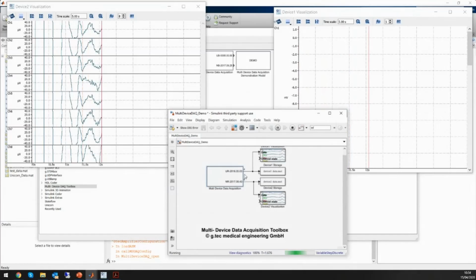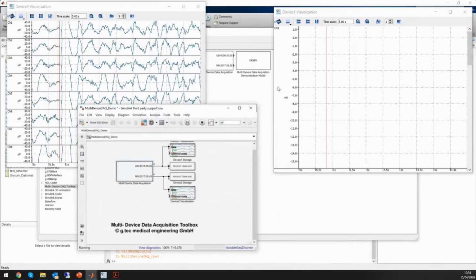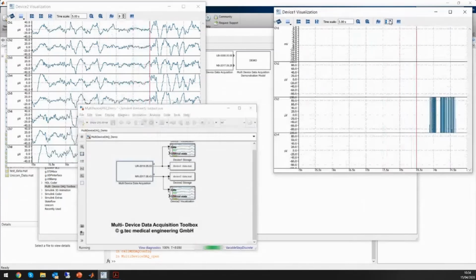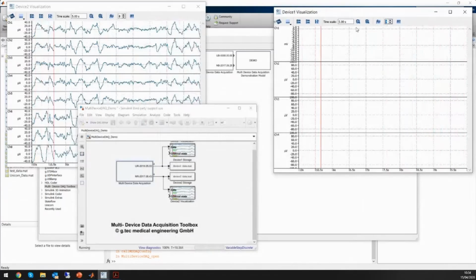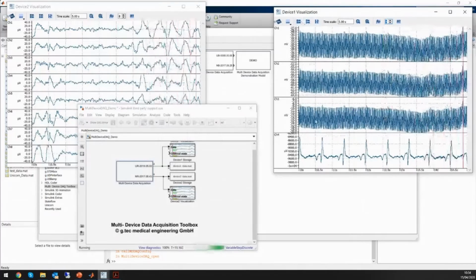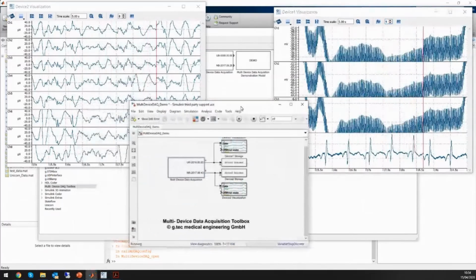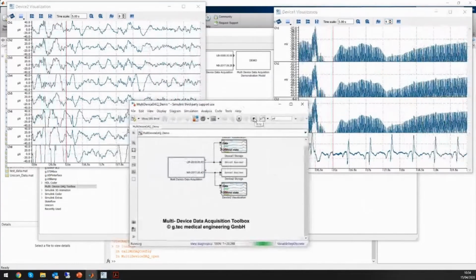Okay, so you can see it updates the number of channels automatically to 4, although I only have one of the channels as active. Yeah, these are just noise based on the reference and grounding. So yeah, really straightforward application.